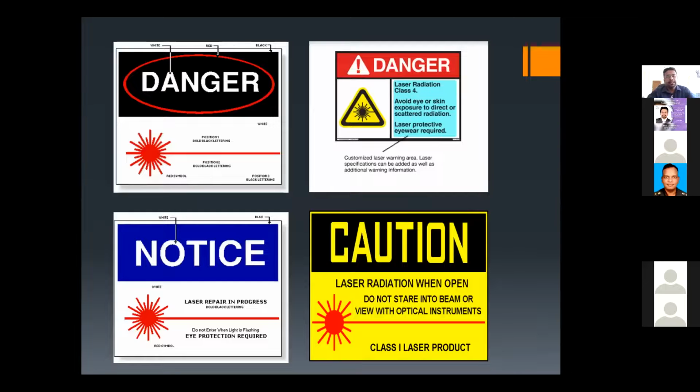These are the laser safety stickers which you should paste outside your operatory. During the operation, no one should enter into the operatory.